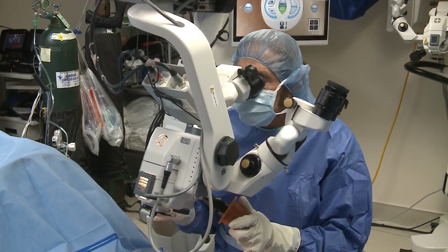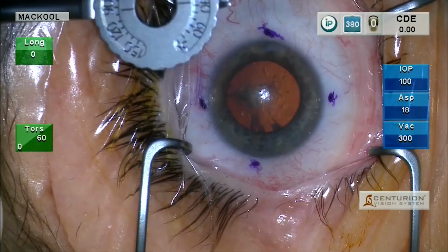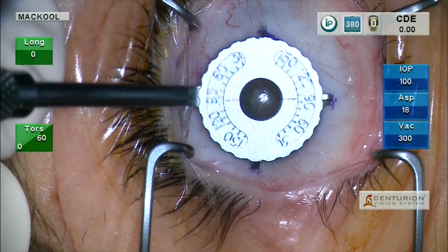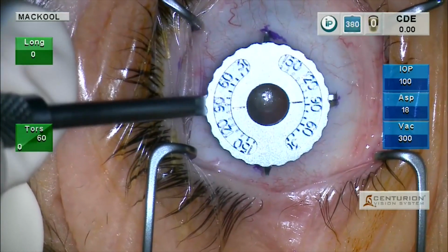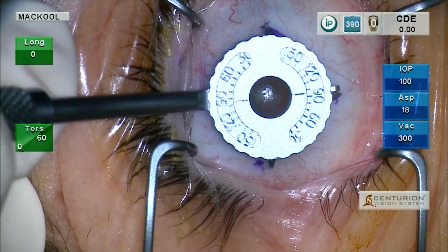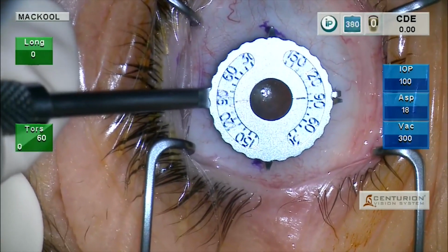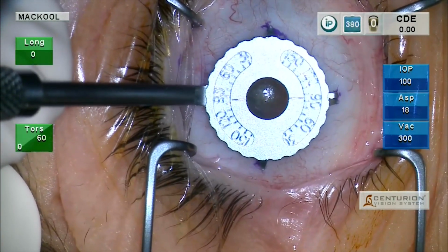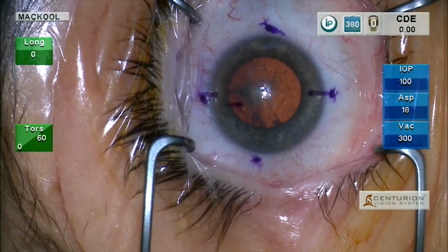So this patient has an obvious posterior subcapsular cataract. Our plan is to put a multifocal toric lens in here, but we want to first mark the axis, which is 97 degrees, shown on the toric axis marker. So this is a right eye, so I'm aligning the 90-degree mark inferiorly and the handle superiorly, and you can see the 2 horizontal blades lining up with the marks there. So that's now our 97-degree axis.